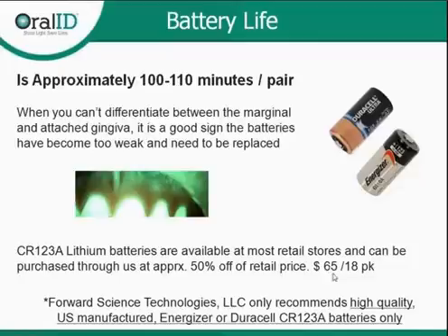I will say that because we buy so many at one time, you can get them for about 50% off of what you would pay retail through us. We sell 18 packs for $65. We also have a referral program. So if you guys are part of a study club or have dental colleagues that are interested and they end up purchasing our device, then we give your office a year's worth of batteries as a thank you for that recommendation. So those are the two ways to get more batteries.